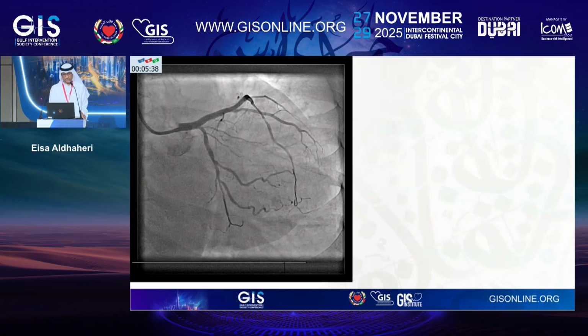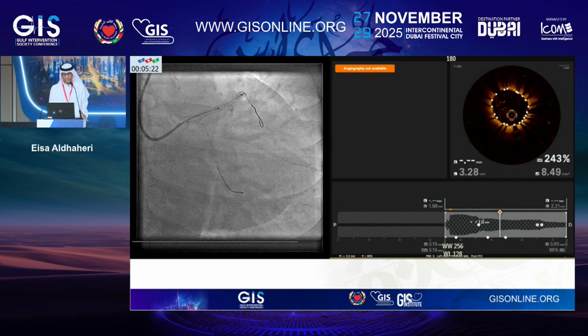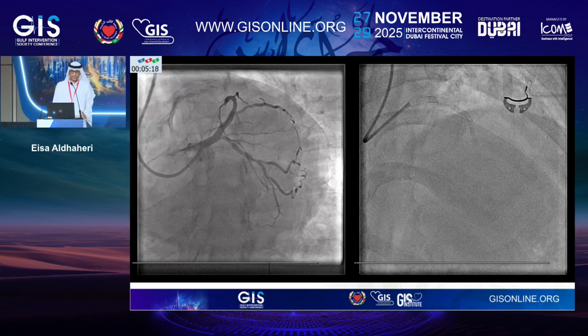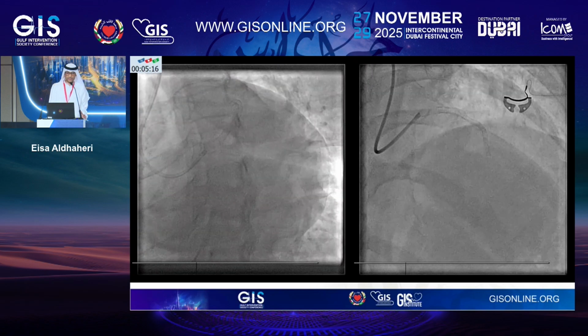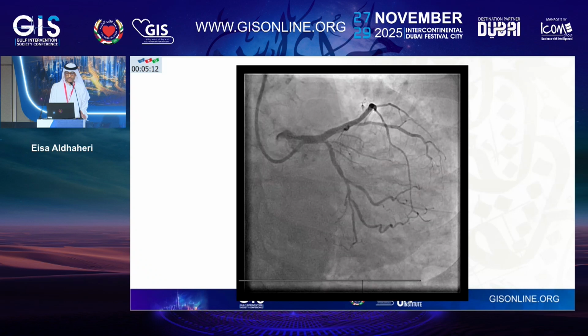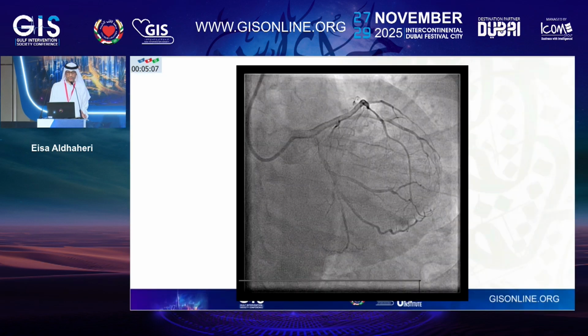So this is the result after the procedure, and we did a final run of OCT to make sure that the stent is well apposed, there are no dissections, and the sizing of the left main is good. So this is the final result by angiography. Still, there is some thrombus maybe on the ostial circ. And we decided to continue with the tirofiban for a couple of days.